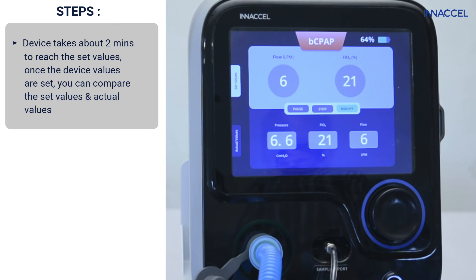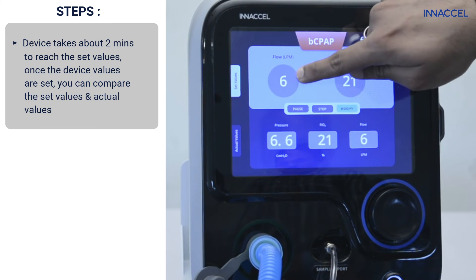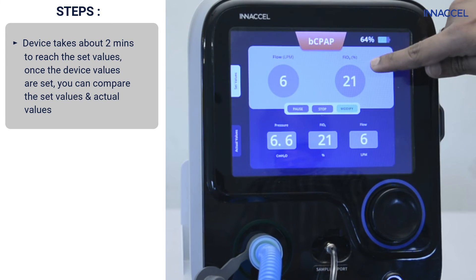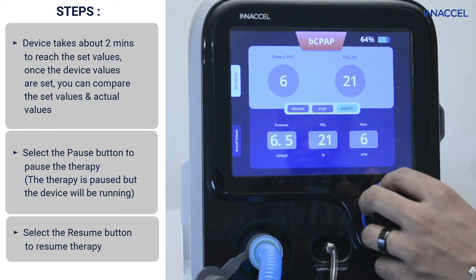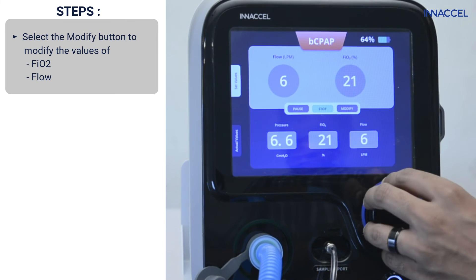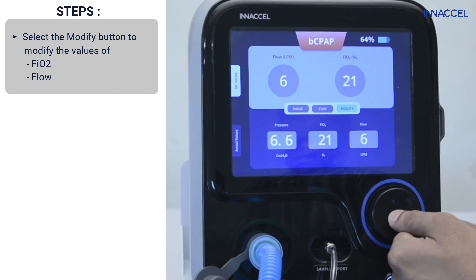Give the device about 2 minutes to reach the set values. The device also provides visual information to compare the set and actual values. You can pause the therapy by pressing the pause button — this doesn't turn off the device, it simply pauses the therapy. You can resume the therapy by pressing the resume button. The flow as well as FiO2 values can be edited using the modify button.